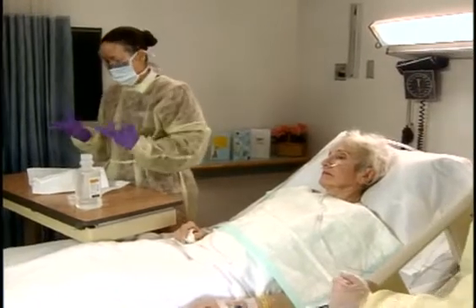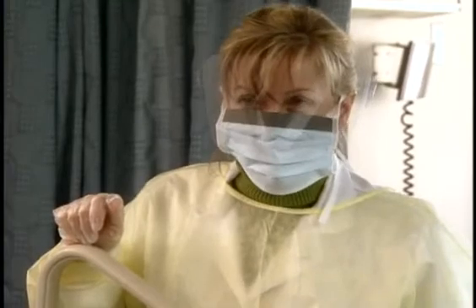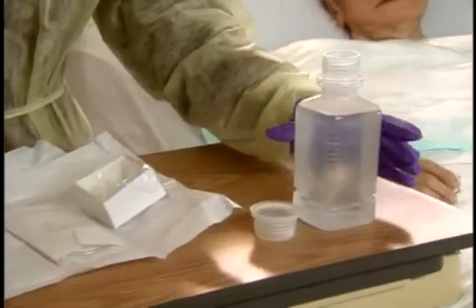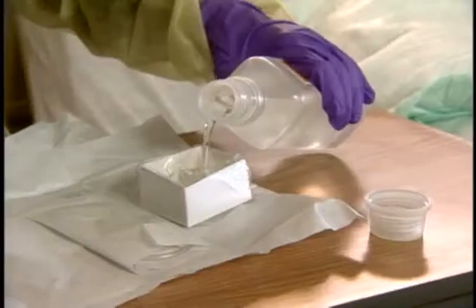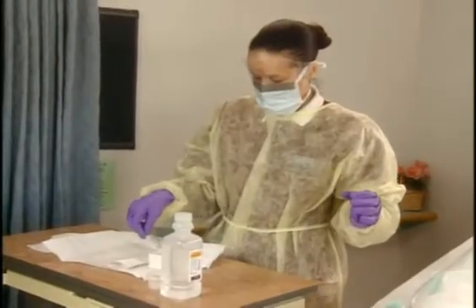Now I set up the sterile container by pouring the sterile saline into it. Right. Your dominant hand will remain sterile during the procedure because it will handle the catheter. Your non-dominant hand can be considered clean rather than sterile, so you can use it to pour the saline. Now pick up the sterile catheter with your dominant hand.